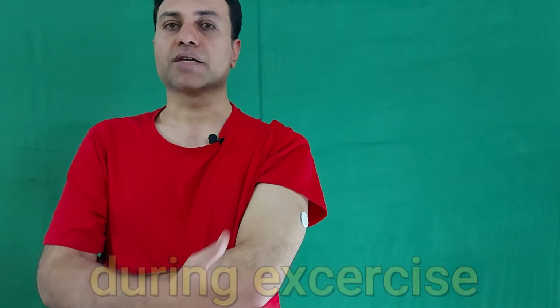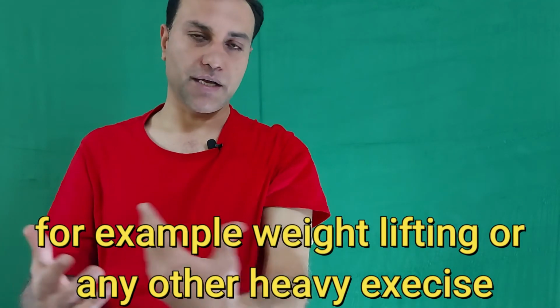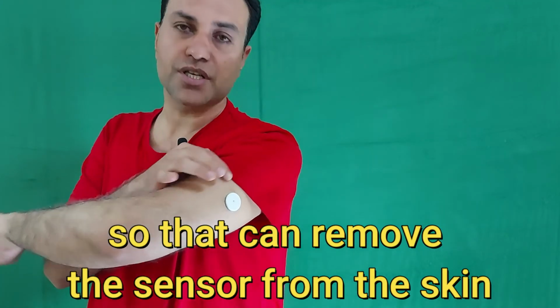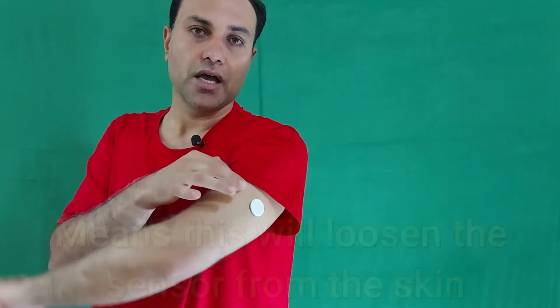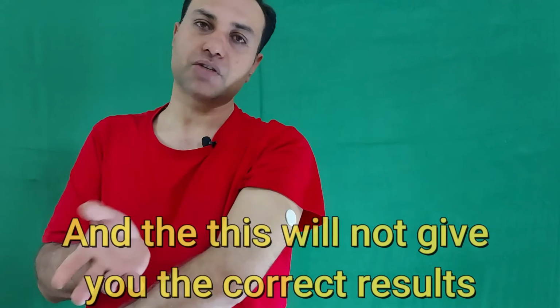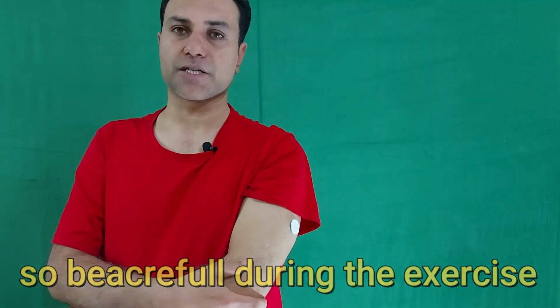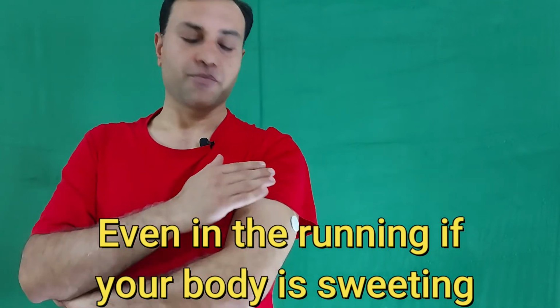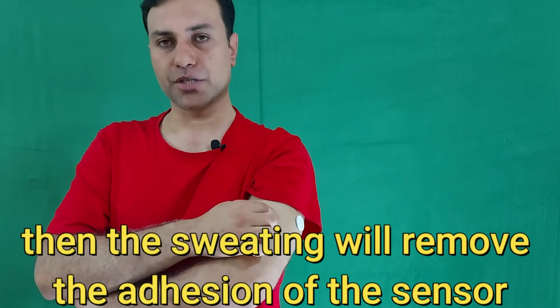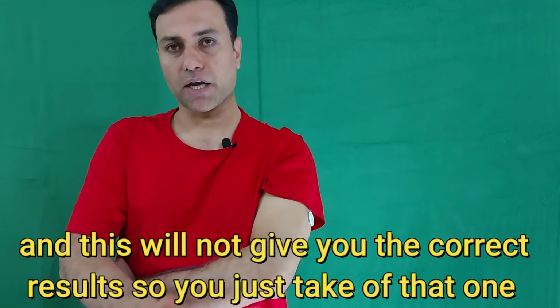During exercise, if someone is doing heavy exercise, for example weightlifting or any other heavy exercise, this can remove the sensor from the skin. This will loosen the sensor from the skin, and this will not give you the correct result. So be careful during exercise. Even running, if your body is sweating too much, the sweating will remove the adhesion of the sensor, and this will not give you the correct result. So just take care of that.